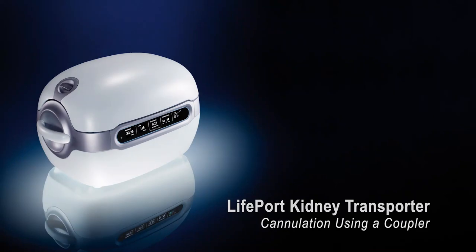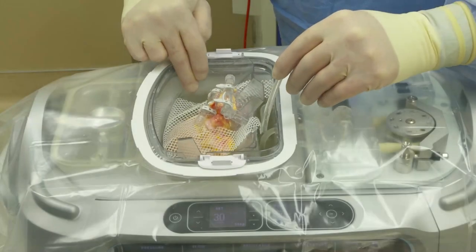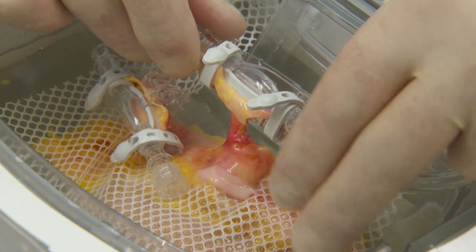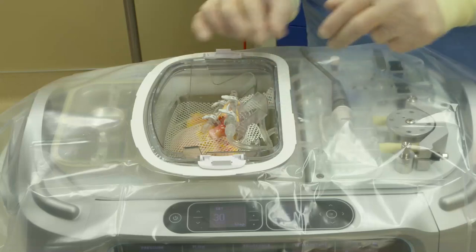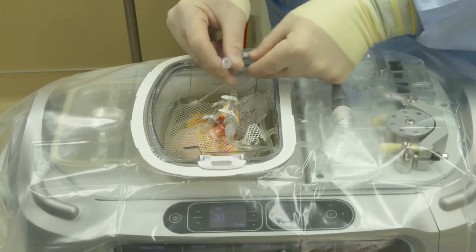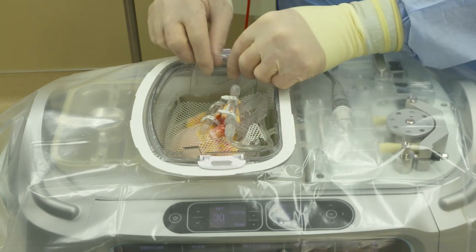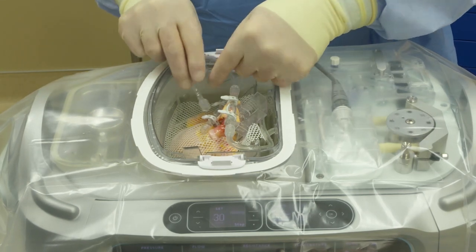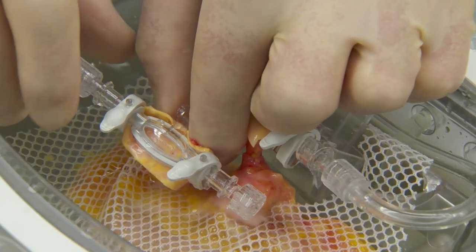Cannulating the kidney: connecting multiple cannulas with a coupler. In some cases, you may have a kidney with multiple vessels that need to be cannulated separately. After each vessel has been cannulated, identify the main vessel and snap that cannula into the cannula mount. Attach the infuse line to this cannula, then replace the end cap with one end of the coupler. Attach the other end of the coupler to the infuse port of the next cannula. This can be repeated for as many couplers as necessary.